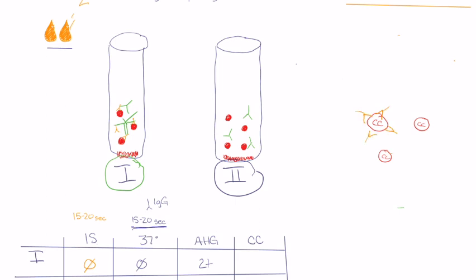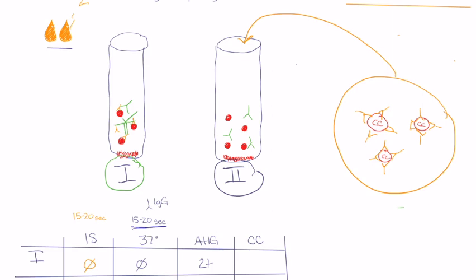Okay. So they are sensitized with antibodies. You see that? So when we add these guys now into here, and remember they only go into our negative tubes, okay?